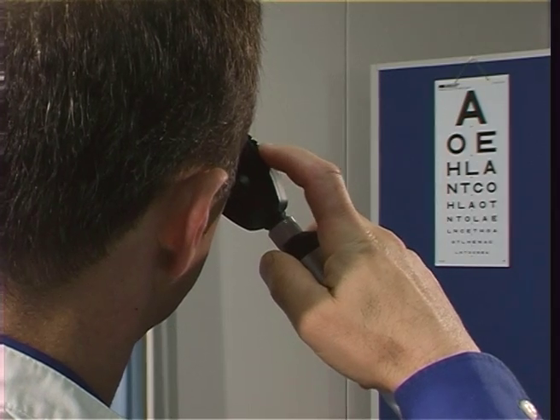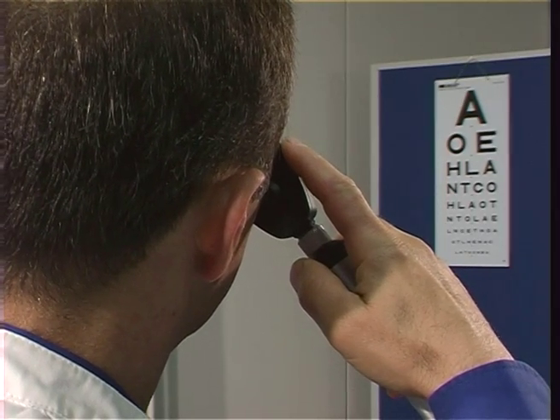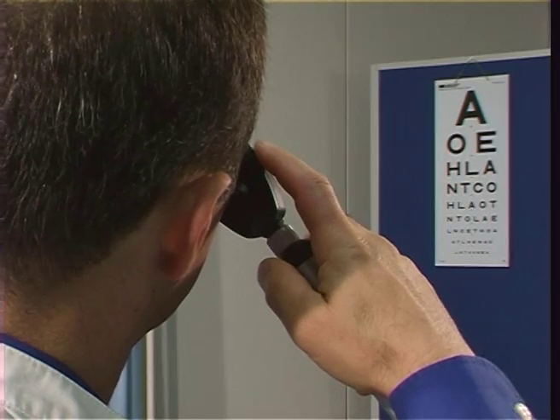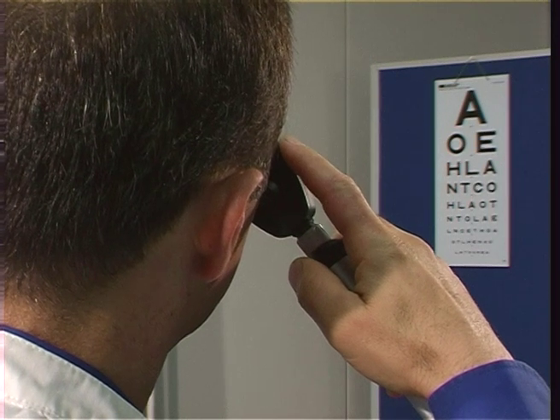Ensure that both you and the patient are in a comfortable position with your eyes at the same level and at about one meter away from each other. Ask the patient to remove their spectacles. Contact lenses do not need to be removed unless they are tinted. You can keep your own spectacles on or remove them as required. If you do remove your own spectacles, you will need to compensate by changing the diopters accordingly. A simple way of adjusting the ophthalmoscope to your own vision is to look at the small writing on the Snellen chart and adjust the lenses until it comes into focus.